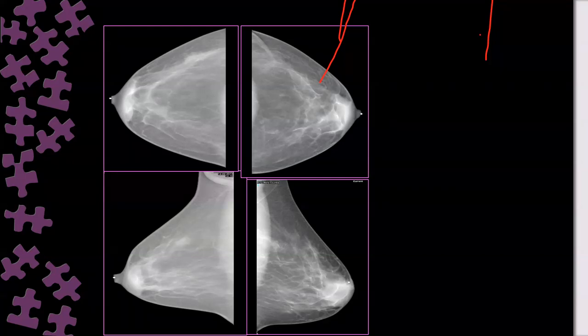No, here we will just go for repeat, since the pectoralis looks like this, we have to repeat. But you can do a trial, and you can check the posterior nipple line.